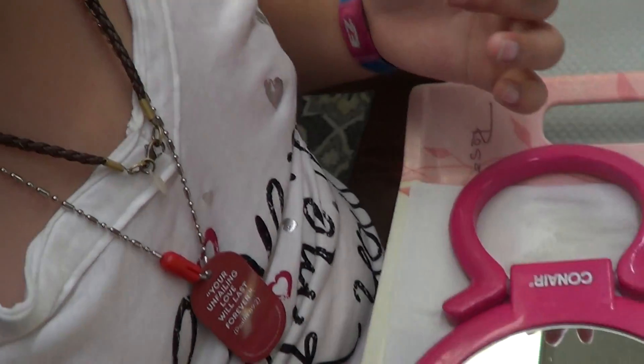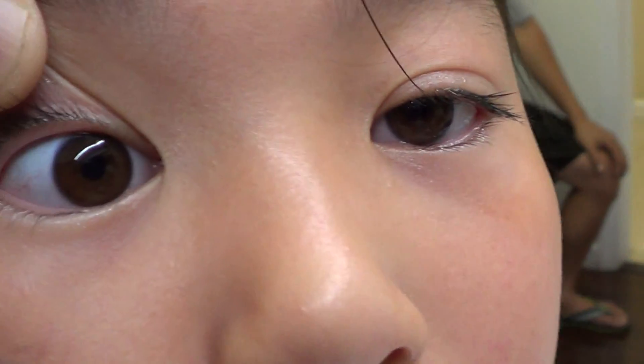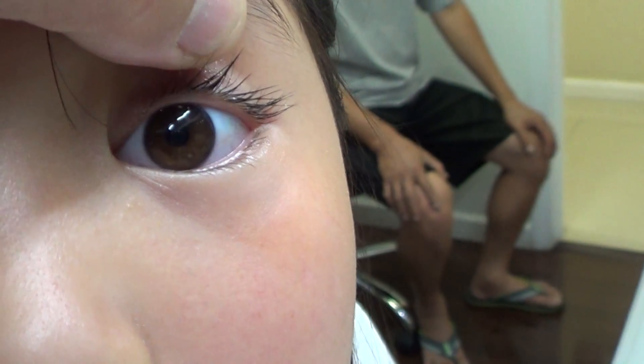And now open your eye. Let me see it — the lens in your eye. Right here on the right side. It's here on the left side.